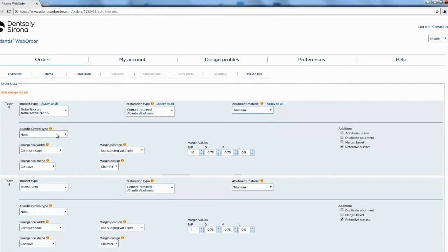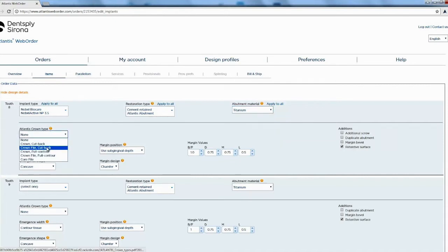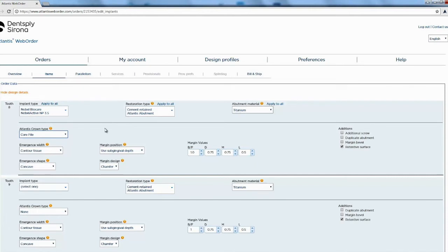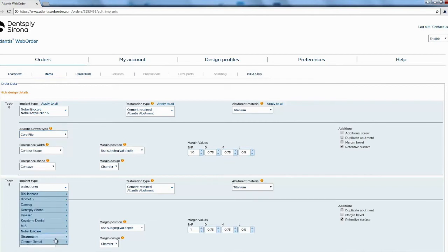Also here you can choose the Atlantis crown type. So do you want a core file back which means after they go ahead and design your abutment and mill it they can send you a core file back that you can import back into InLab and start designing while you're waiting for your abutment to come back. So you go ahead and fill out this for each implant.